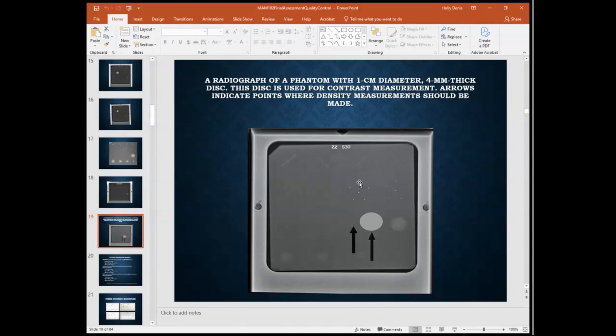And then moving on to my specks, I can see 6 little specks here, 6 little specks here, 6 little specks here. On mine, I see 4 of them. I can see at least 4 on this one. 1, 2, 3, and then this middle one I can see. I can't see the 2 bottom ones on mine. So I would still, 4 counts as a full. So I would count that as 1, 2, 3, 4.